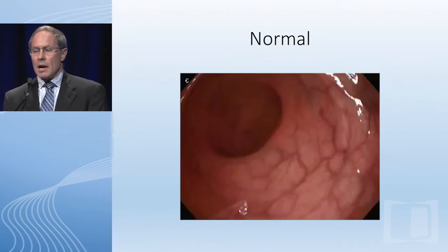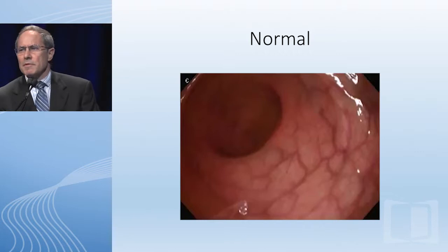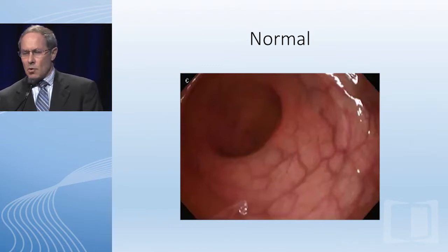Now I'm going to share with you a series of videos which will demonstrate some of the descriptors, some of the features that I've shared with you already. So let's go back on that one, and do that once again. I unfortunately don't have control of that here. Can you go back one more time and don't advance immediately? I want to just show you that there's normal arborization of the mucosa here and the absence of any tissue defects. So again, this is normal.